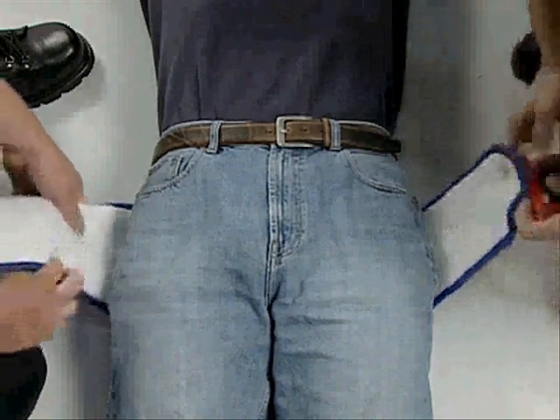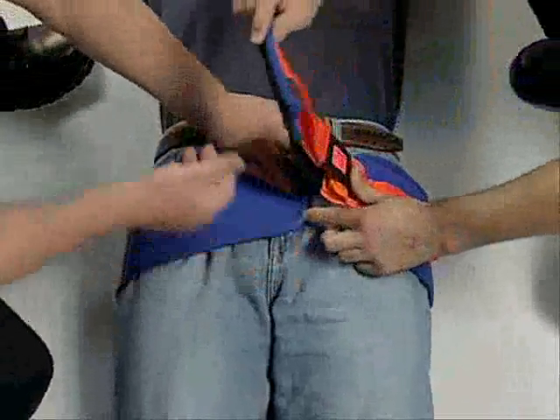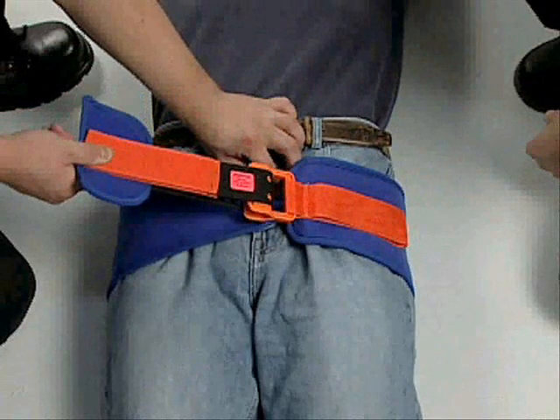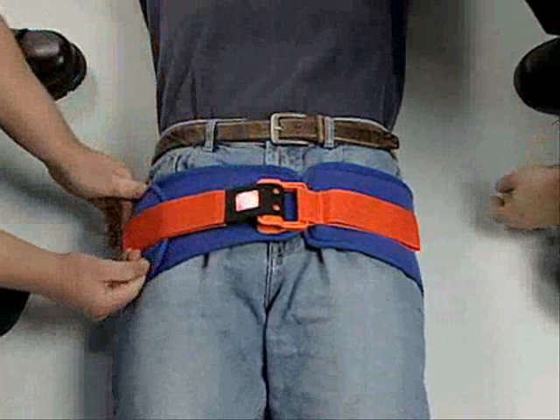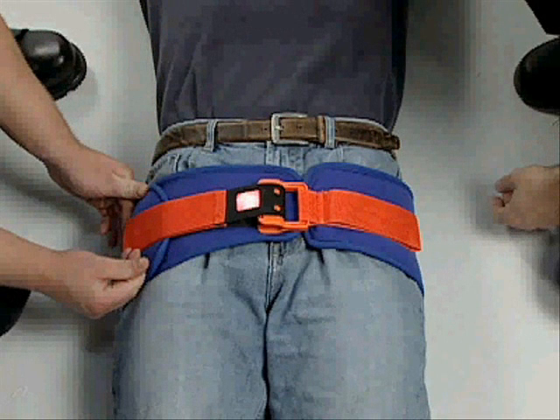Next, firmly wrap the padded flap and webbing around the body to ensure a snug fit. Secure the sling to the patient by pressing the Velcro-type surface of the padded flap against the blue belt.